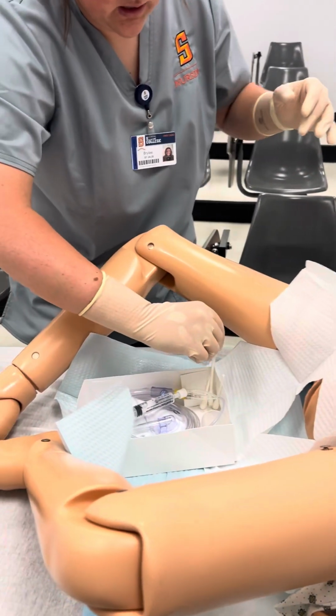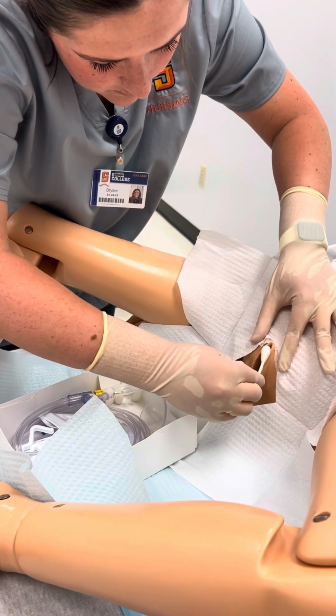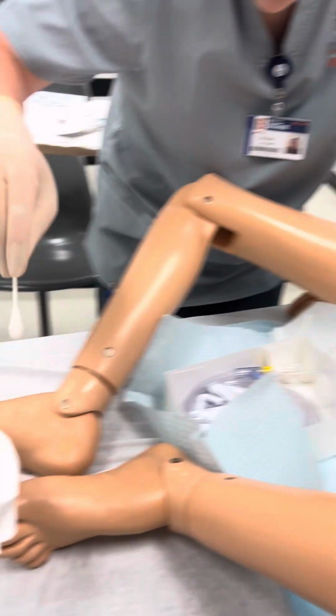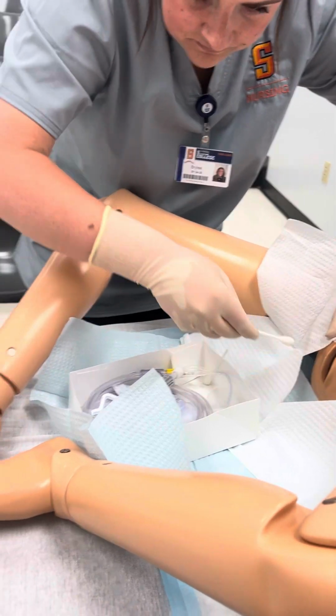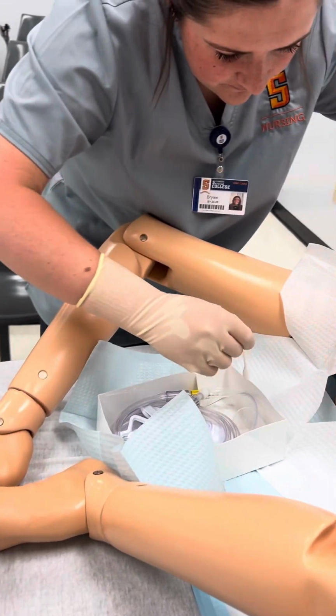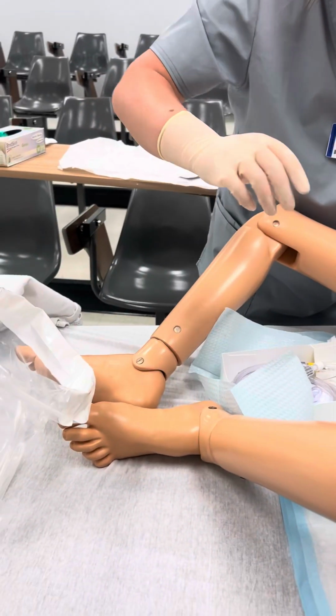Okay, and now what I'm gonna do is I'm gonna spread the labia and do one side top to bottom. Throw the swab away. Same with the other side, top to bottom. Swab away. And then right down the middle, top to bottom, throw the swab away.